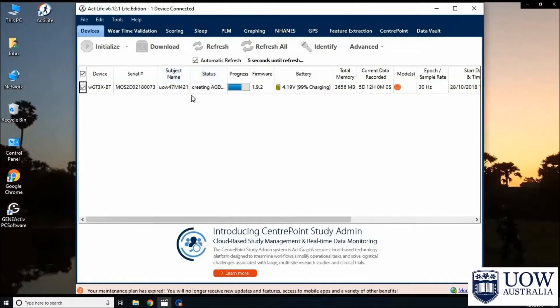Look at the status column. You will see that the status says finish downloading when the data download is finished.